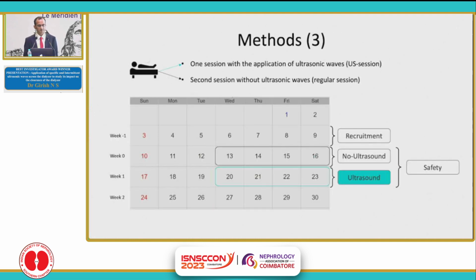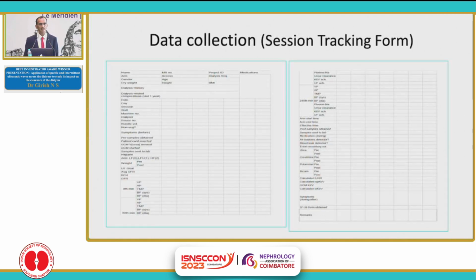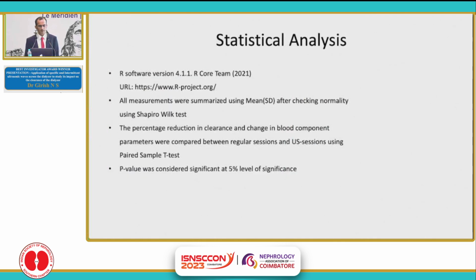Each patient had a week where there was no ultrasound, followed by a week where they received ultrasound therapy, preferably not during the long gap weekend, but during the mid-week or the end of week sessions. At all points we were having safety checks. We collected data on numerous parameters through these forms, and we took help of a professional statistician to do the relevant statistical analysis to calculate our results.